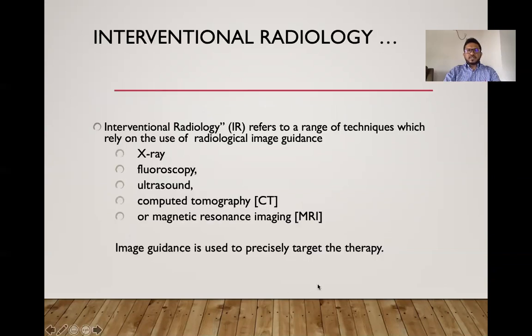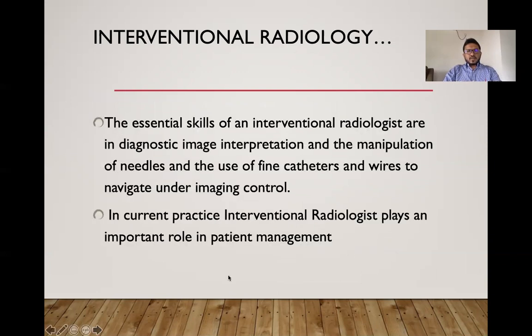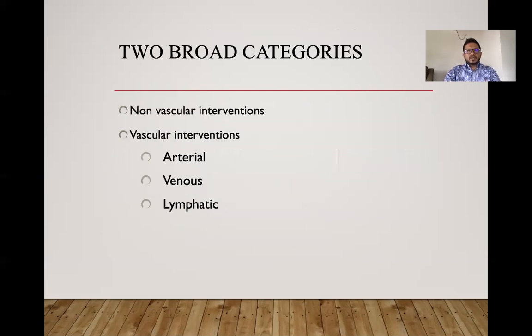Basically, interventional radiology is using different imaging modalities to guide our therapy and target precise treatment to a particular organ. The basic skill required of an interventional radiologist is to use the available imaging modalities to manipulate needles and catheters and navigate under image control. In current practice, interventional radiologists play a very important role in patient management. There are two broad categories: vascular and non-vascular. Within vascular you have arterial, venous, and lymphatic interventions.